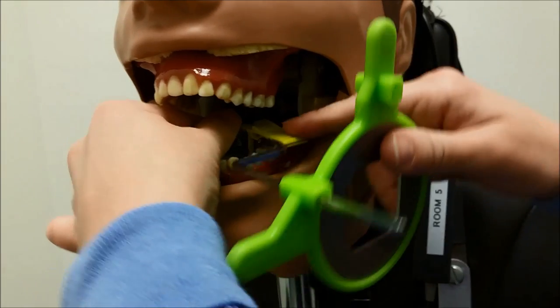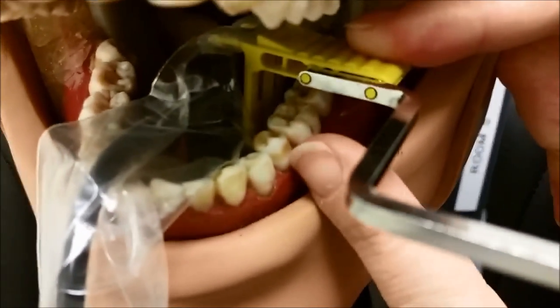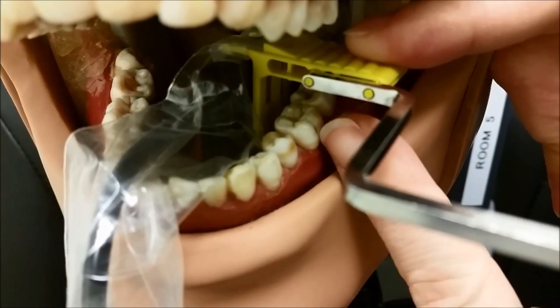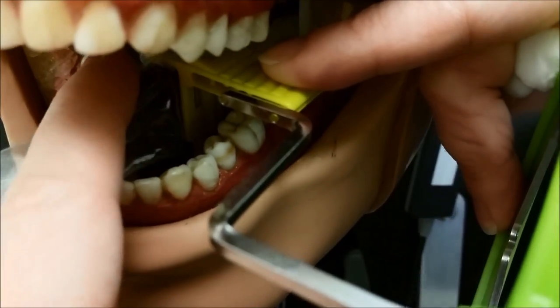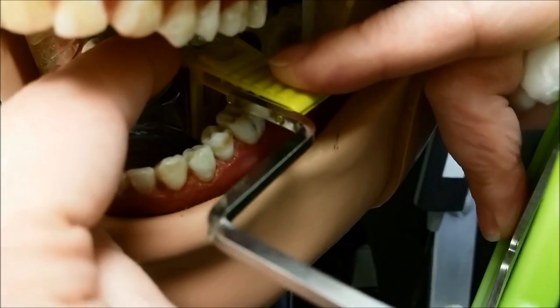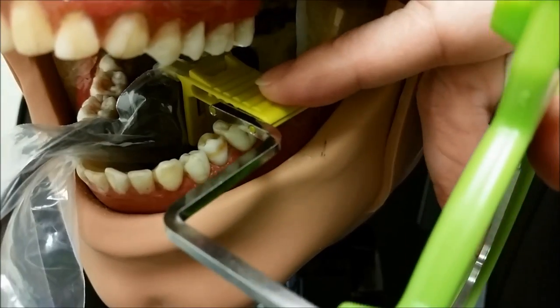So we're going to visibly make sure that we open up the contact, trying to aim between the contact of the second premolar and the first molar. You want to bring the sensor as far forward as you can while maintaining that contact of your second premolar and first molar.